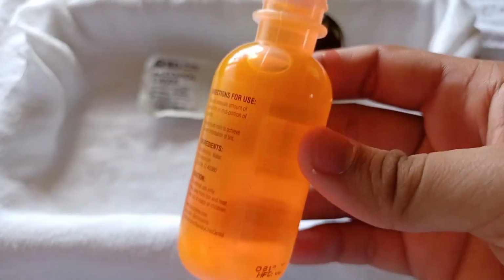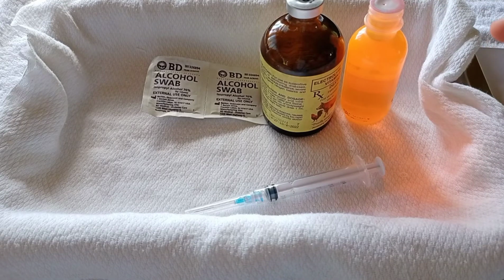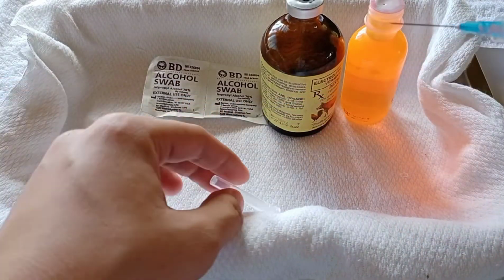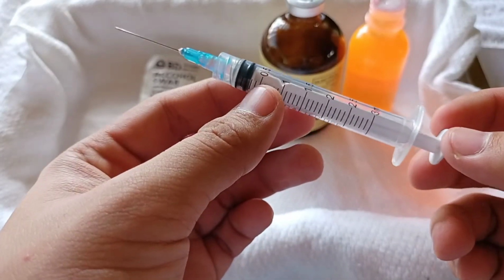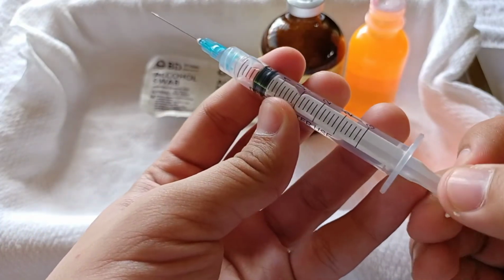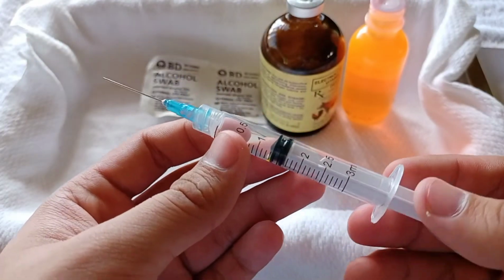After putting the diluent in the vial, it's time for you to withdraw the medication. In withdrawing the medication, you just open the cover of your needle syringe. Then withdraw the plunger down the exact amount that you are going to get from the medication vial. If it is 1.5 ml, measure 1.5 ml.